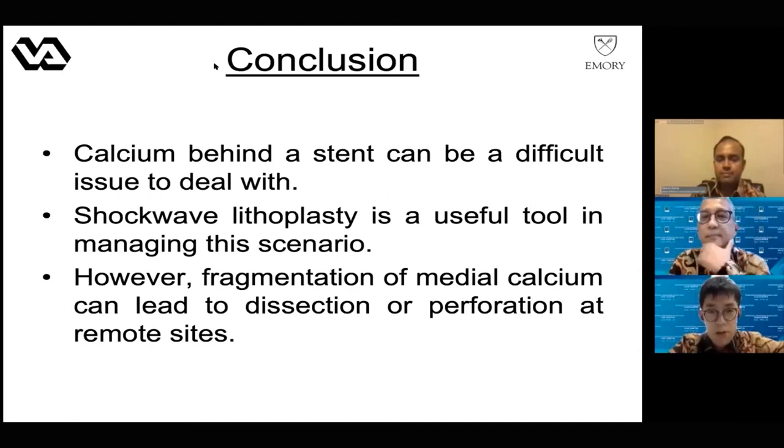My question is the indication of the excimer laser bubbling technique for this region. Are you asking me? Yeah. Okay, everybody can answer that.